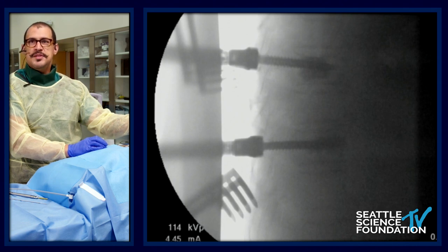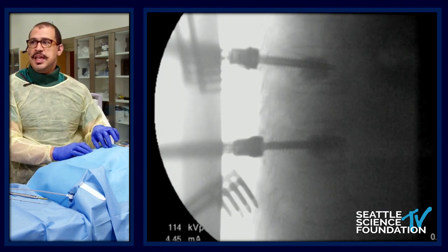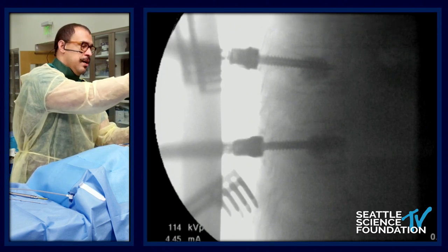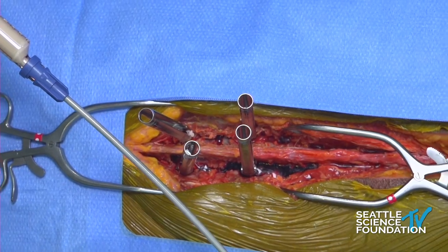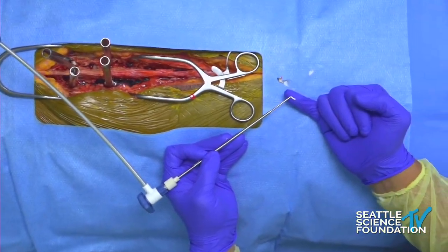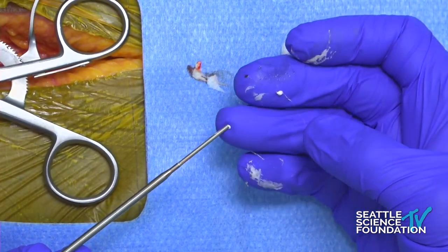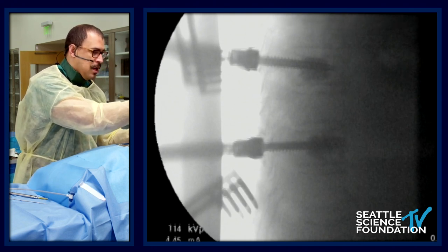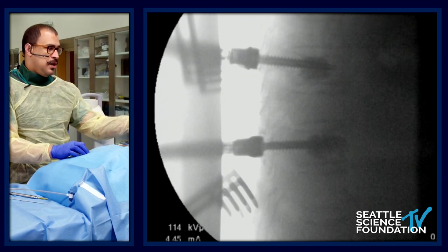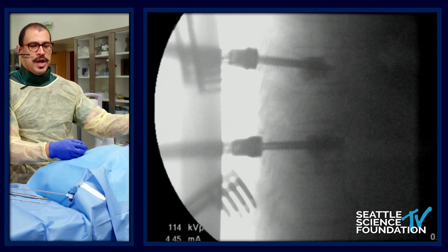Amir, can you hear us? How much pressure do you have to exert, and how is this cement different in its viscosity than regular PMMA? I'm told that this is higher viscosity — we don't want to have that extravasation of your typical cement. I would always check it — zoom in so you can see this coming out. Always actually check how that cement looks and feels before you put it in. If it's too liquidy, it's higher risk for extravasation. You always want to make sure that you like what you're seeing before you place that cement. About 1.5 cc per screw — that gives me enough fill and provides purchase strength without overdoing it.